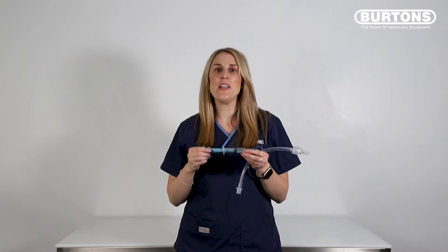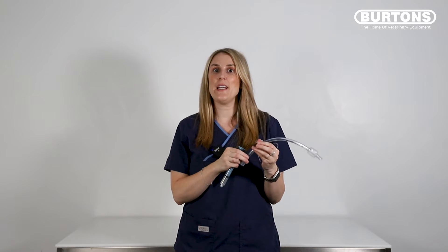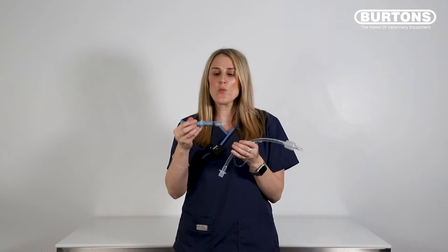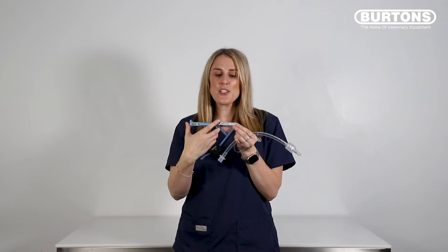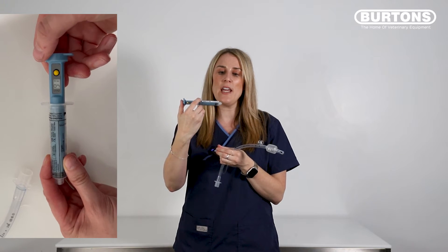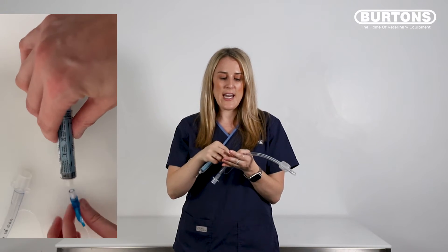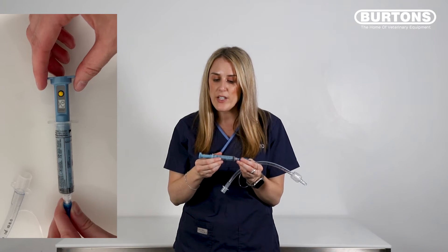We can also use our AG Cuff Fill as a way to check the pressure in an ET tube that is already in place during anesthesia, or we could use it to check the cuff of the tracheostomy tube in a patient in the ICU. What you want to do — which is different to when we inflate the cuff — is push the plunger all the way to the very end, turn on the AG Cuff Fill, attach it onto our inflation line, and then we can read the pressure.